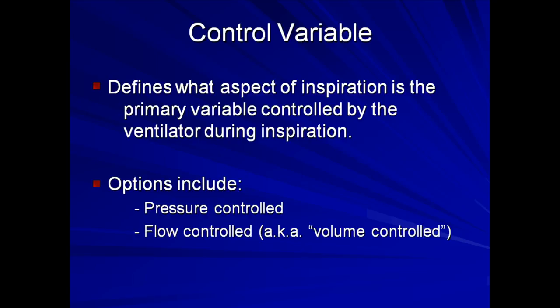It should be noted that most clinicians and even many textbooks refer to flow-controlled, volume-cycled ventilation, such as most forms of assist control and SIMV, as, quote, volume-controlled. Although this seems like a logical description, as the clinician is directly specifying and thus controlling the tidal volume to be delivered, the ventilator is actually controlling the flow rate.